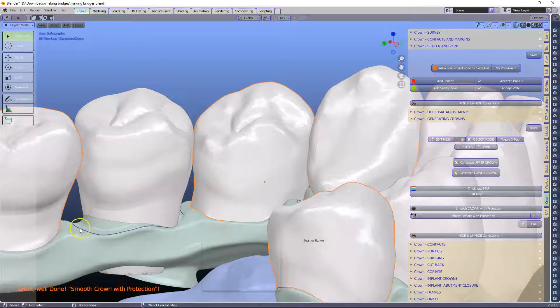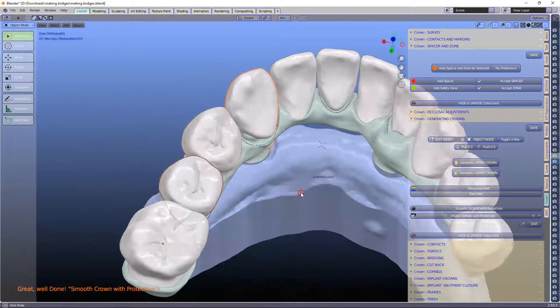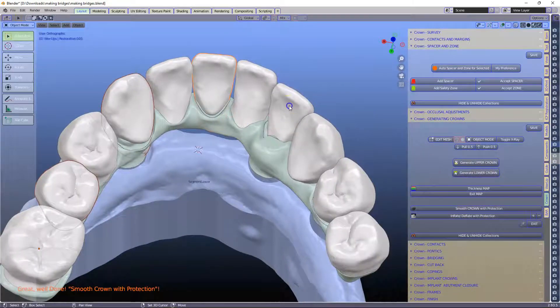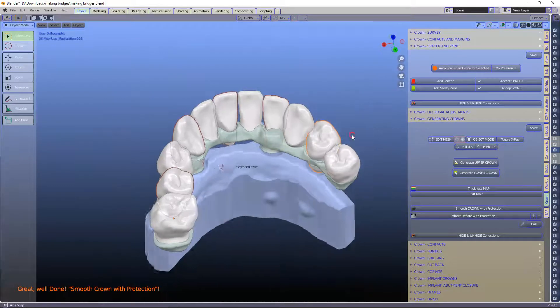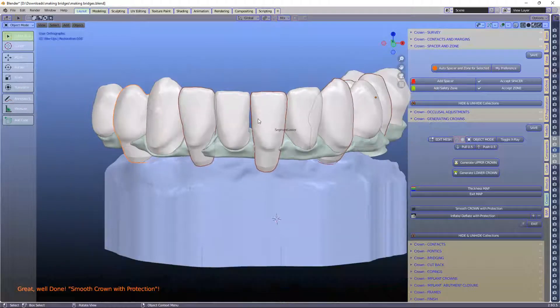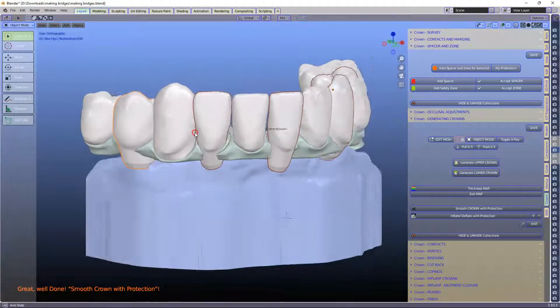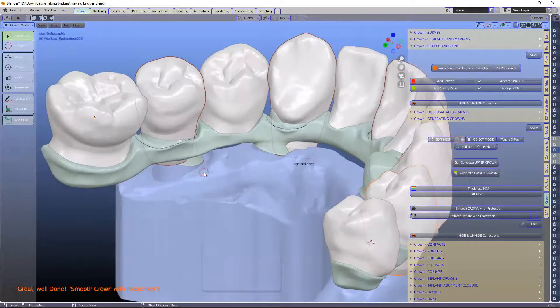I also want to show you how forgiving this actually is, because it's taken it from the margin. This one is far away from the margin, and this one is also far away from the margin. I'm going to pick all the alternate teeth again. This one is also quite far away from the margin, but this saves a lot of time — you only have to press twice as opposed to every single tooth.